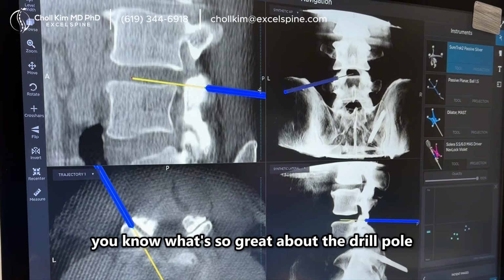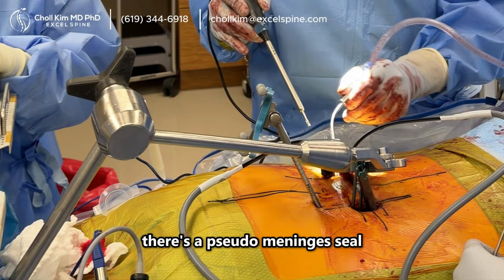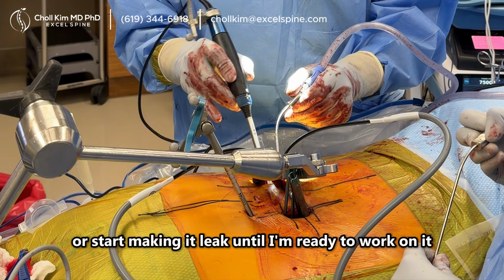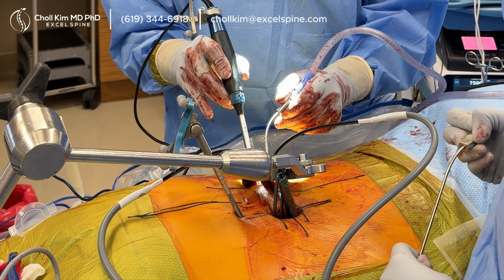You know what's so great about the DuraPro for this particular case? There's a pseudomeningocele, and I don't want to even get near it right now or start making it leak until I'm ready to work on it. And I'm really working right next to it.